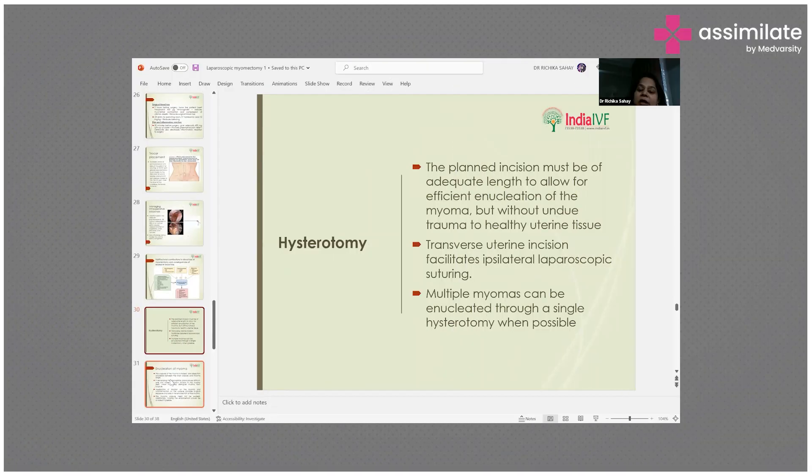The planned incision must be of adequate length to allow for efficient enucleation of the myoma but without undue trauma to healthy uterine tissue. Transverse uterine incision facilitates ipsilateral laparoscopic suturing. Multiple myomas can be enucleated through a single hysterotomy when possible.